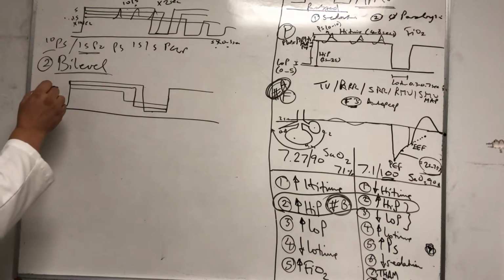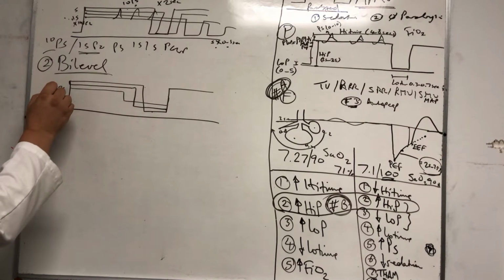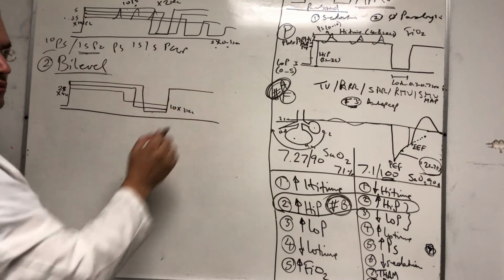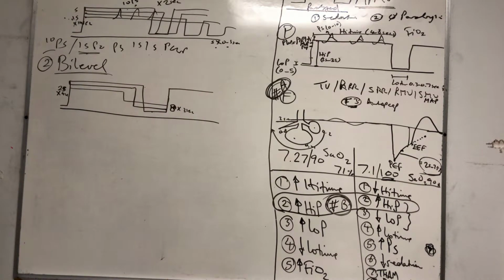So let's say you reach this one: 20 or 25 for 4 seconds, and this became 10 for 3 seconds, or 8 for 3 seconds. Okay? And we're getting closer to each other now. And you want to switch them now to pressure support. Once you start to go into bi-level territory, you can do SBT twice a day as usual. But what's the equivalent settings here?